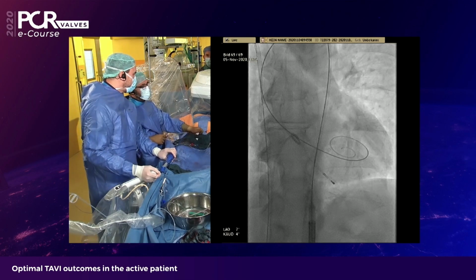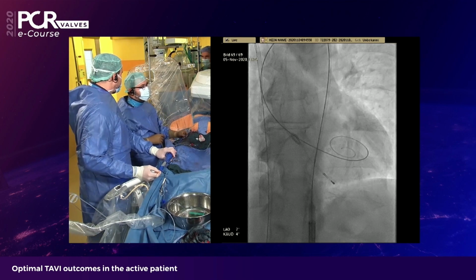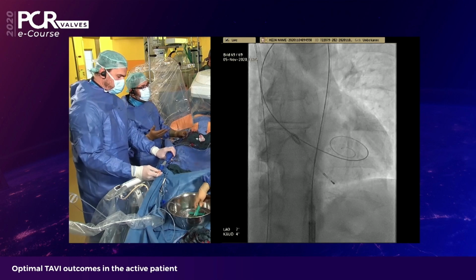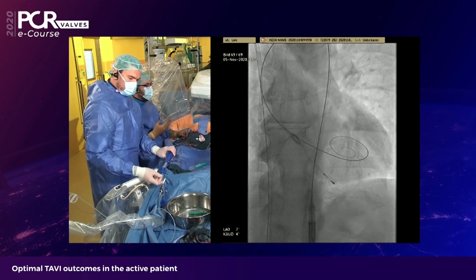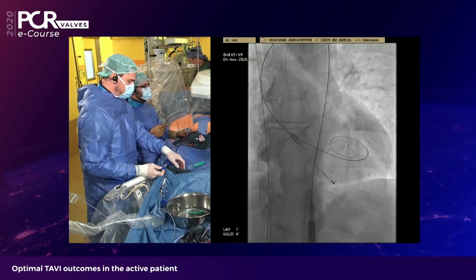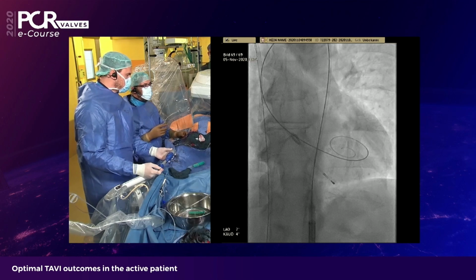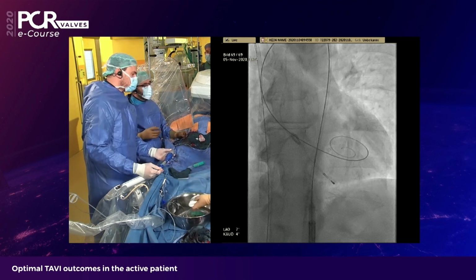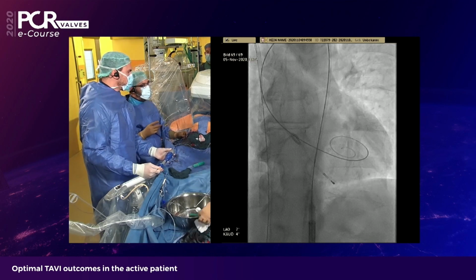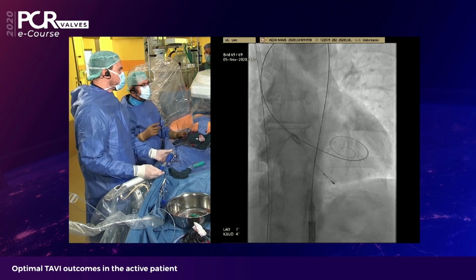And, of course, she is 77 years old, and I think we clearly decided for a transcatheter procedure. Small anatomy could be something that can favor TAVI, but there are also a lot of surgical options. We can discuss this, of course, as well. The short membranous septum could be, in my opinion, an argument for surgery, because I'm not sure whether we have total control in the case of a very short septum, as in her case.